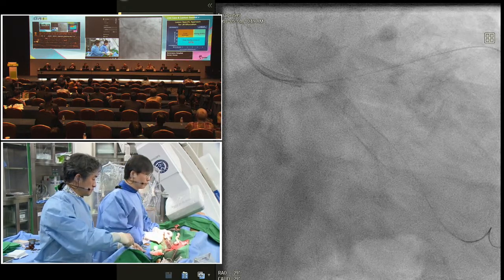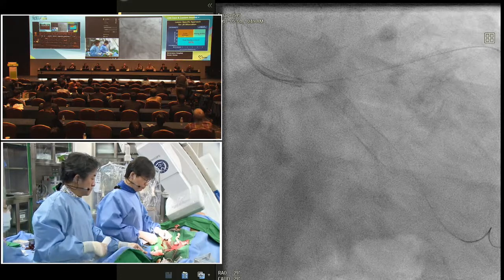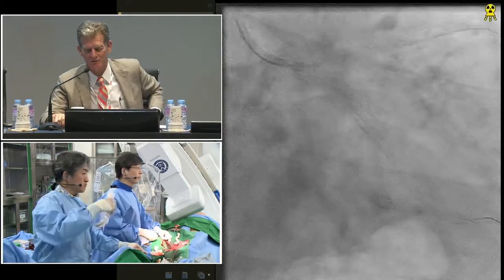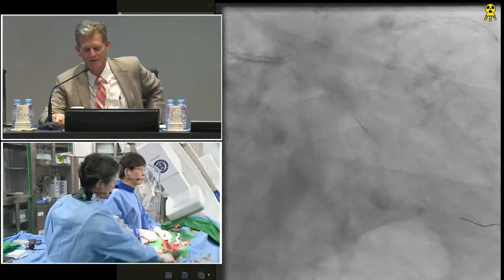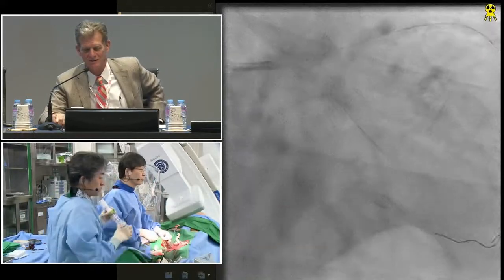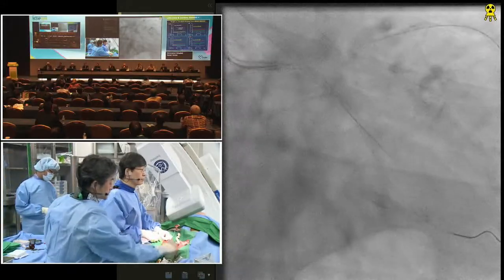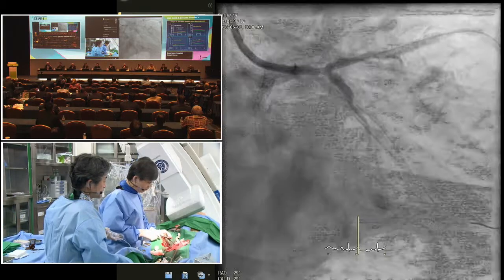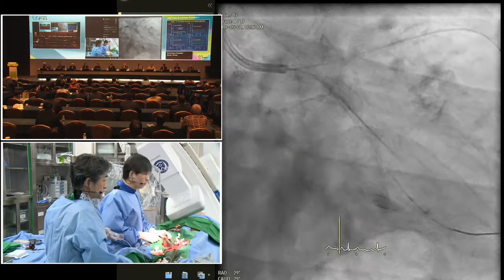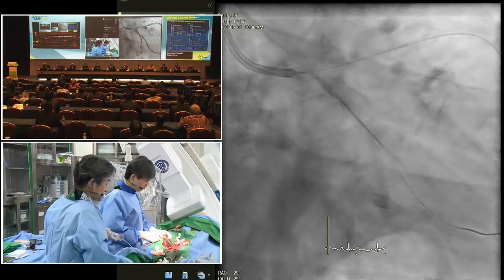Totally agree. I think this is a two-stent case. Both vessels are severely diseased. There's a lot of calcium. It's going to be complex, and there's an ulcerated plaque right at the carina. So to me, this is a two-stent case. I think we would expect a lot of carina shift after the stent implantation. So I am in favor of a two-stent technique, either a double kissing crush or a culotte, at the discretion of the operator.